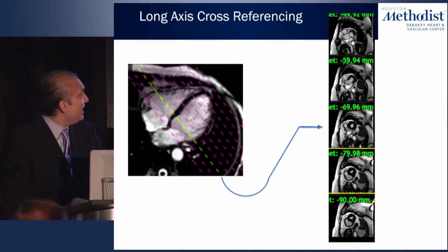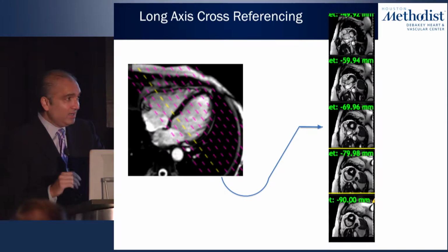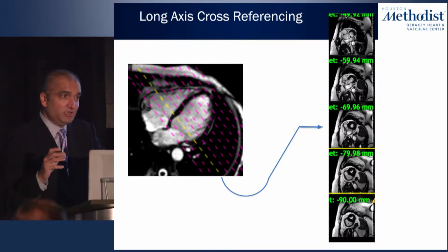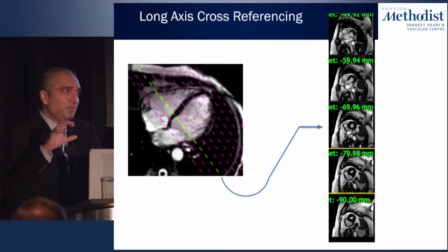So, a few caveats I think are important to keep in mind, and again, these are some of the lessons I think we learned from echocardiography. Typically in echo, when you take a 3D echo acquisition into a post-processing workstation, you're making sure that you account for the basal plane.